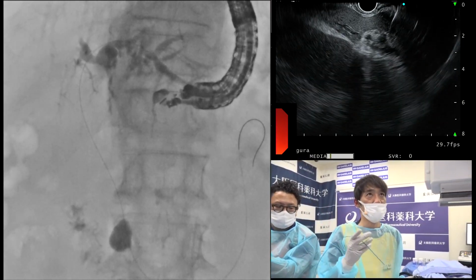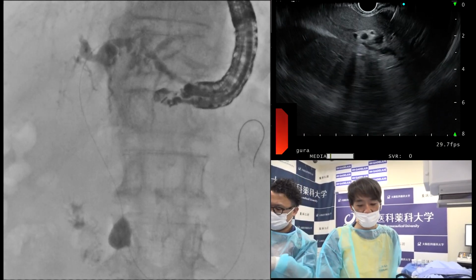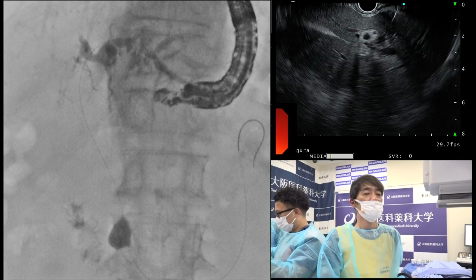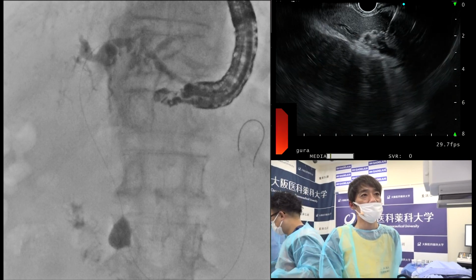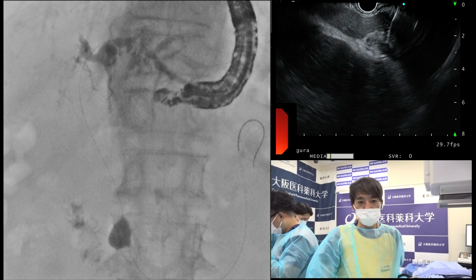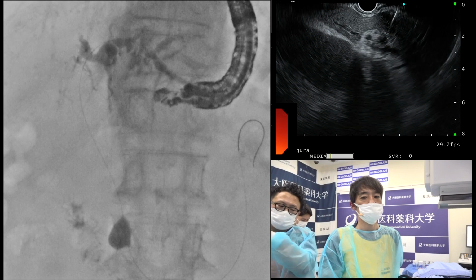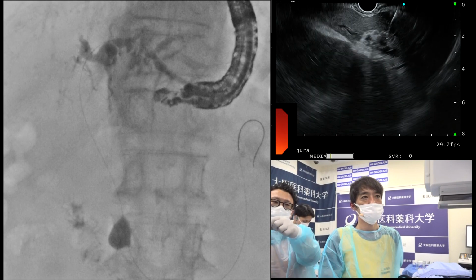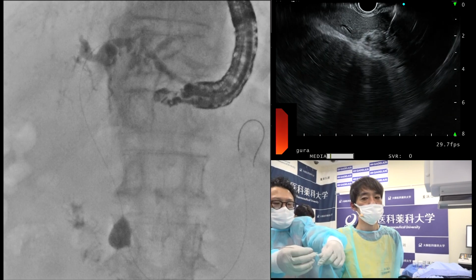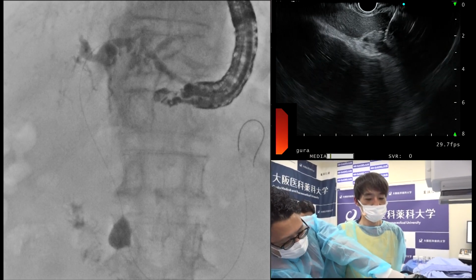Okay, we now dilate the tract for the biliary tract and stomach wall. So we deploy the antegrade stenting. Anthony, can you comment on your beautiful study in Gastro recently on EUS-guided choledochoduodenostomy? Would you have preferred this in this case? How would you have gone about it?